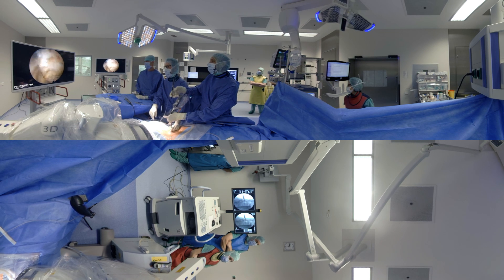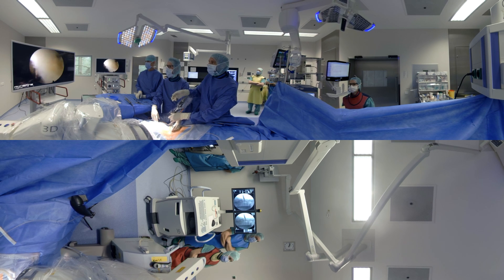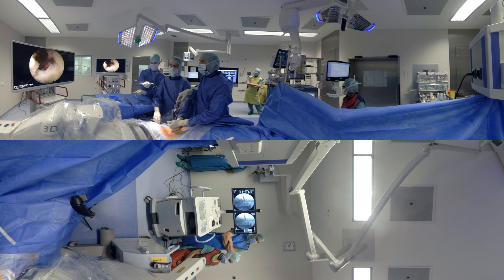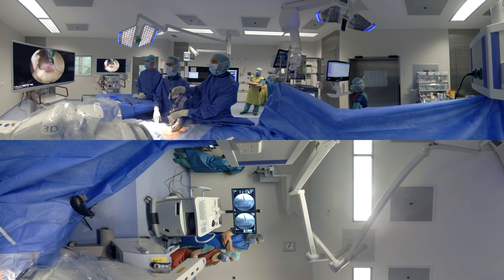There is our yellow ligament here. We only need to resect part of the yellow ligament. With this interlaminar technique you can do discectomies, soft disc pathologies, decompressions, ipsilateral recess decompressions, all types of decompressions, and synovial facet joint resections. Here you can see we just opened the spinal canal — you can see epidural fat here. Now you simply rotate the instrument, go in like that, and start taking bites towards the ipsilateral side. You can see every single epidural vessel here — great visualisation.